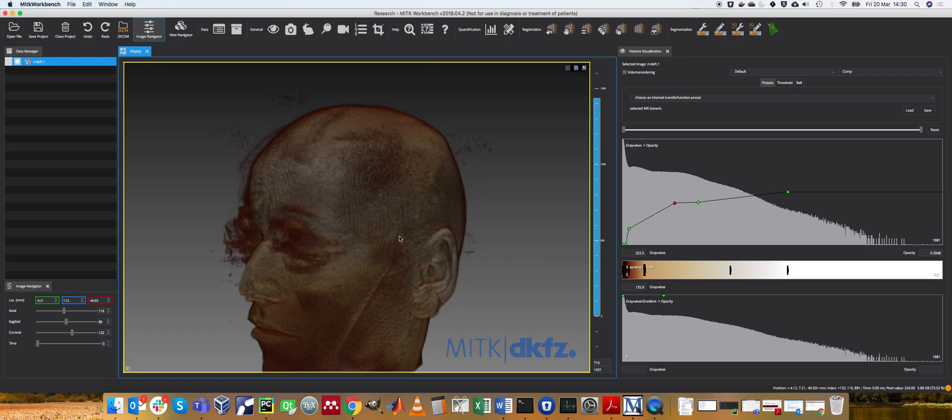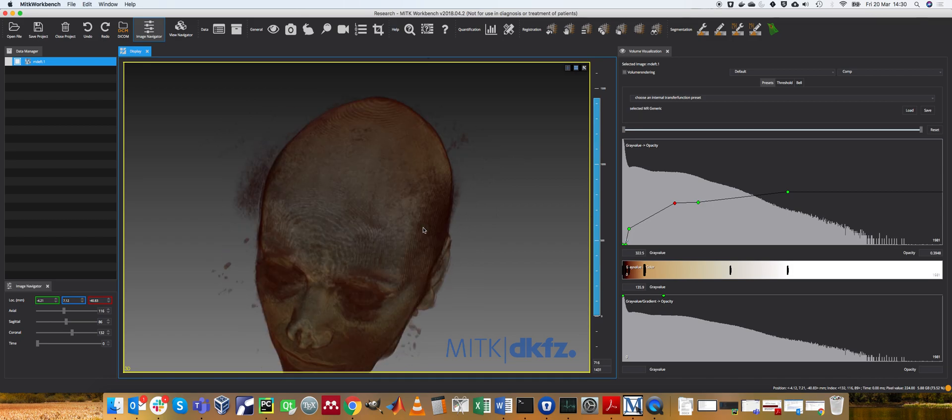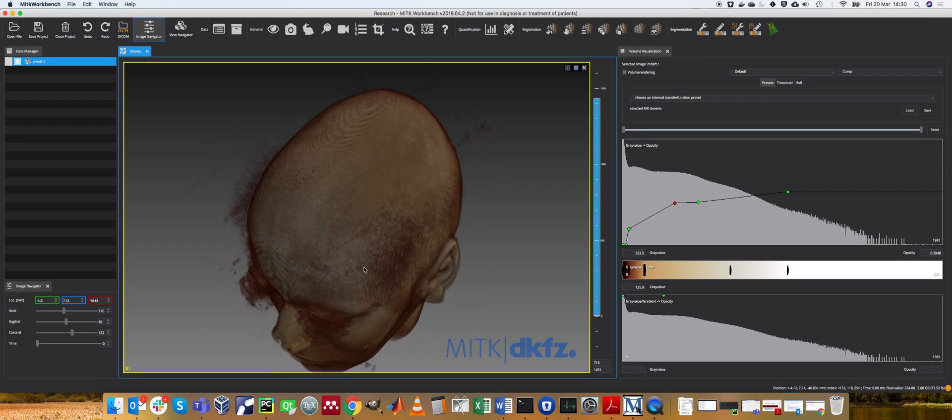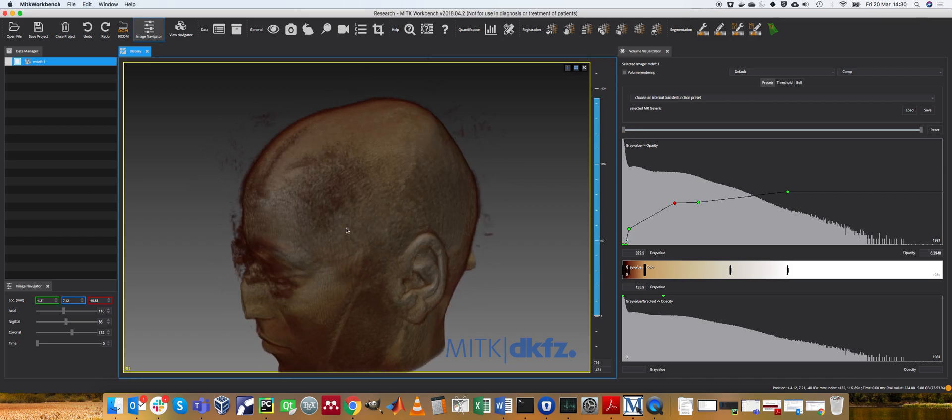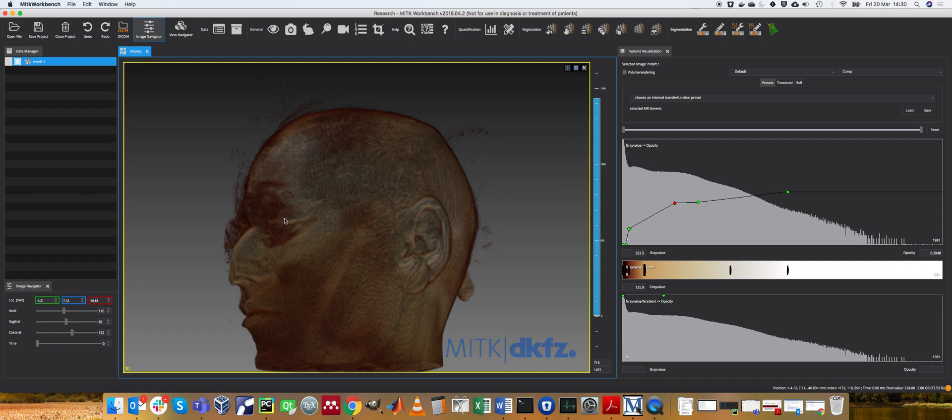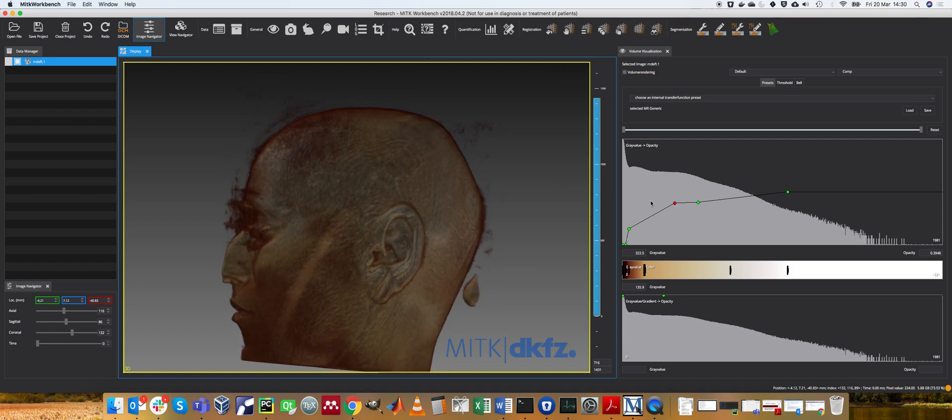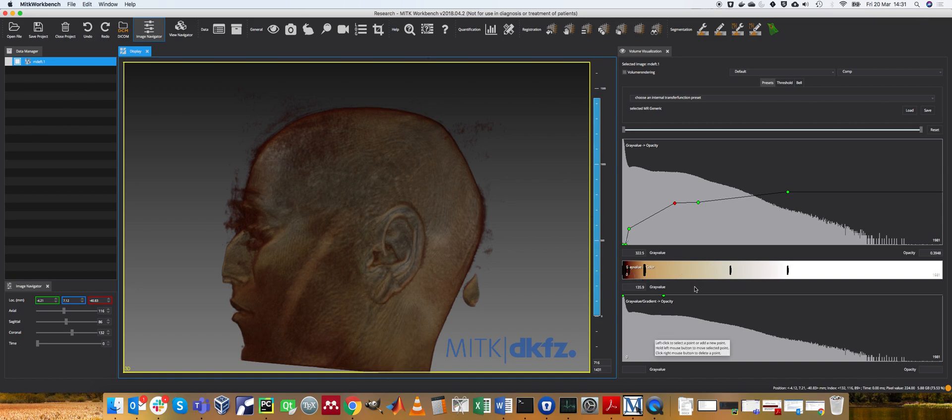So this concludes kind of what volume visualization is. I hope that's been illustrative. So there's no segmentation is the key take home. And it's all controlled by either intensity to opacity, intensity to color, or gradient to opacity transfer functions.